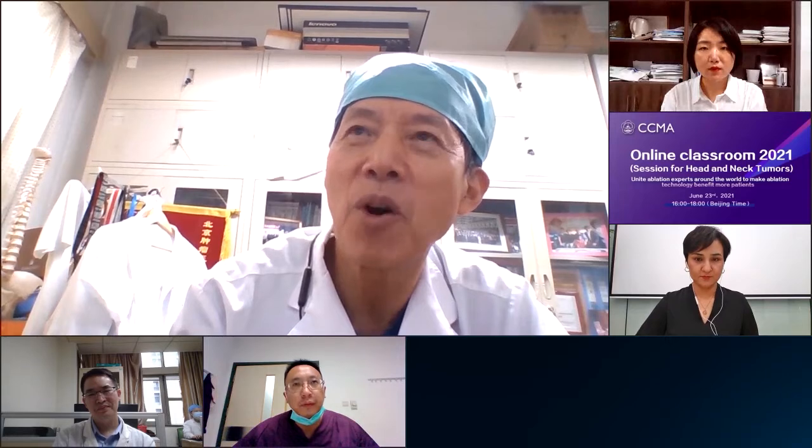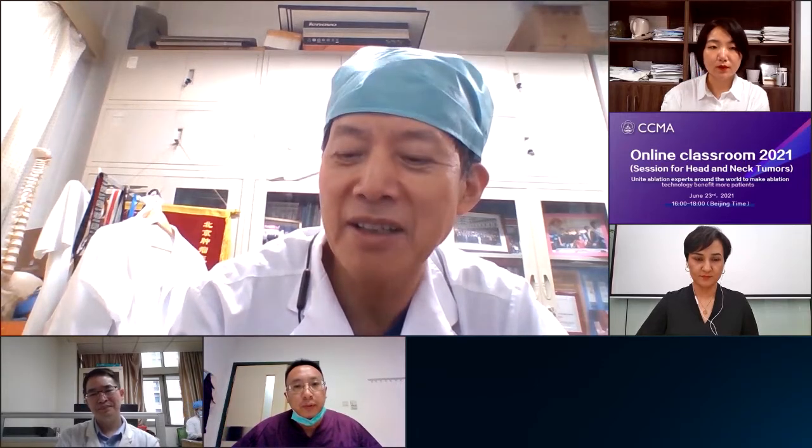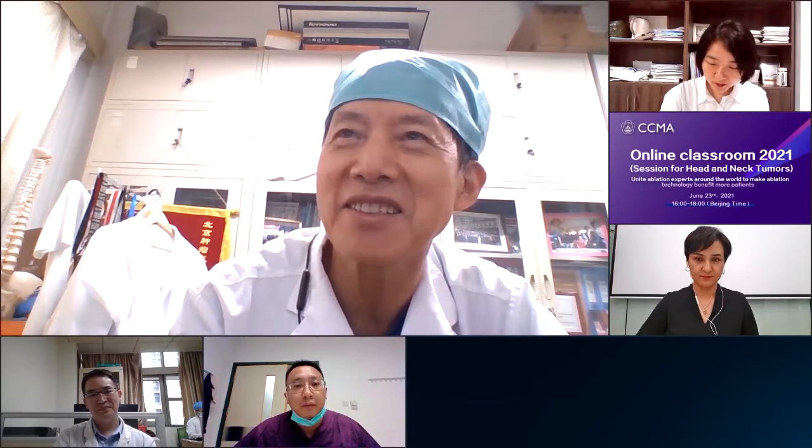So Dr. Chen said, for this question from the Egypt doctor, the key point is that first we should aspirate the liquid in the cystic thyroid nodule. Why? Because it avoids bleeding during the procedure. This is very important.